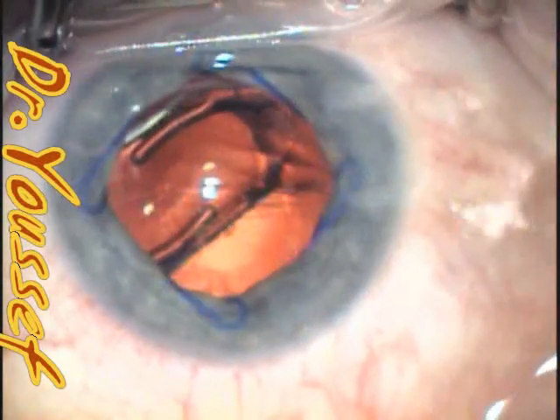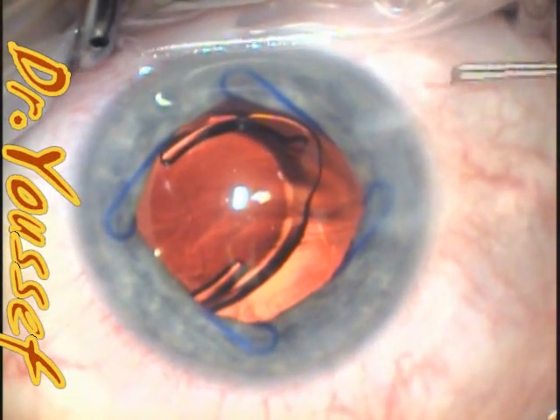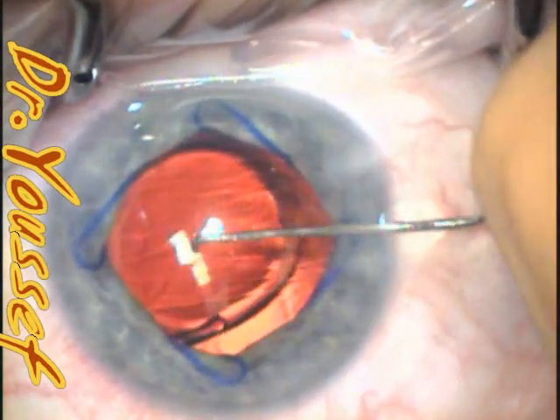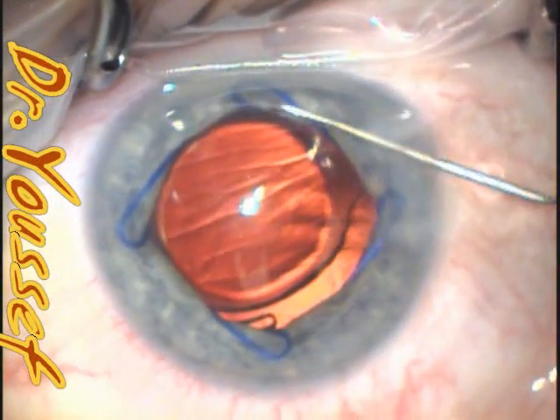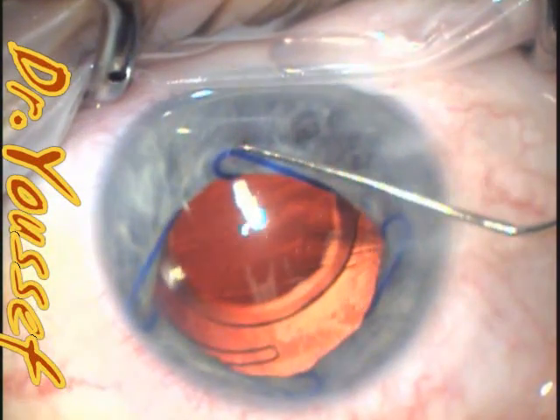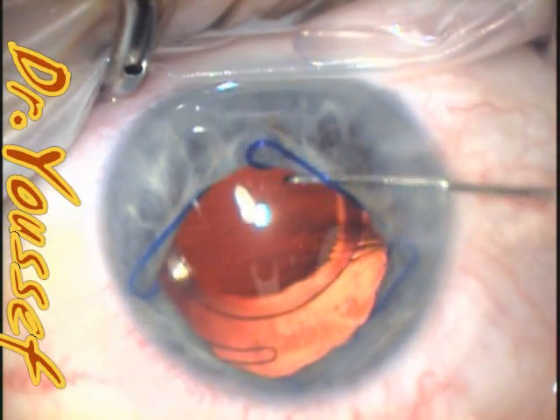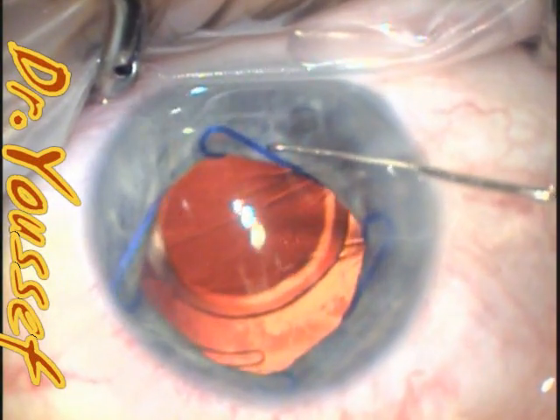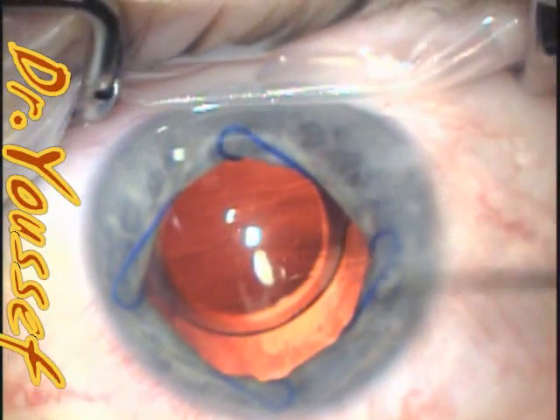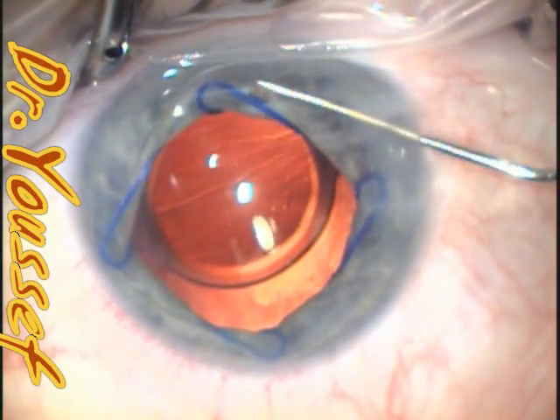I've skipped the phaco part and this is the lens implantation. At this stage I'll show you how to disengage and remove the ring. This is the ZCB-00, a Tecnis lens from AMO. I'll remove the superior ring first rather than the temporal one. I'm not using the proper tool here — it's a Sinskey — so I'll replace it with something I can actually use to remove the ring more effectively.